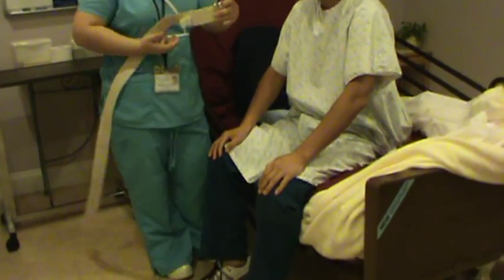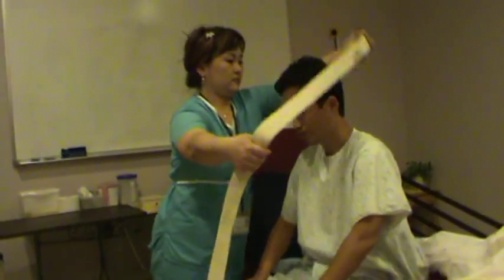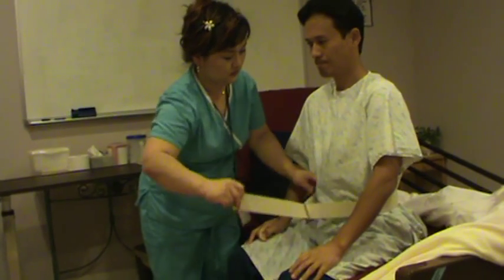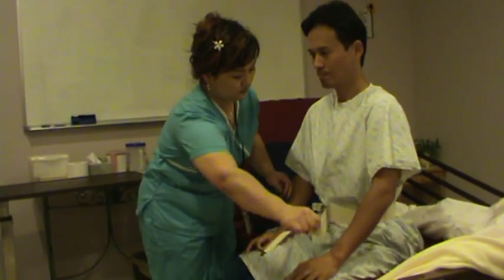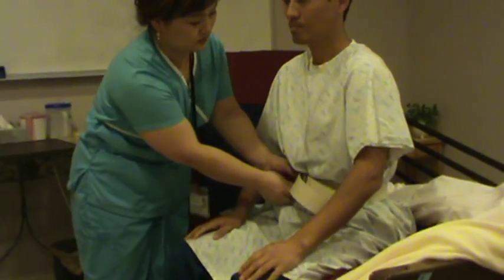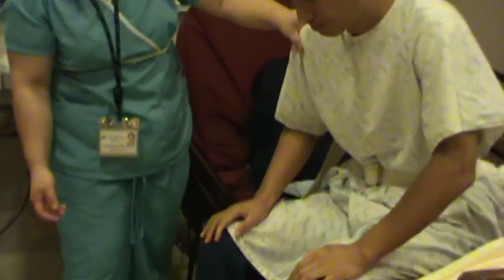Now I'm going to put the gait belt on. Make sure this peg is on the outside of the body. Okay, and put it on this side. Mr. Smith, can you scoot just a little bit more? Very good. Now I'm checking the bed — making sure it's locked. That height is okay for him. His foot is touching the floor, so he's safe.